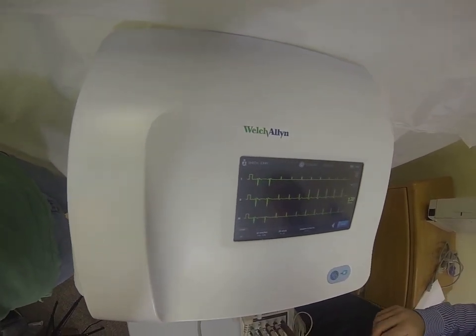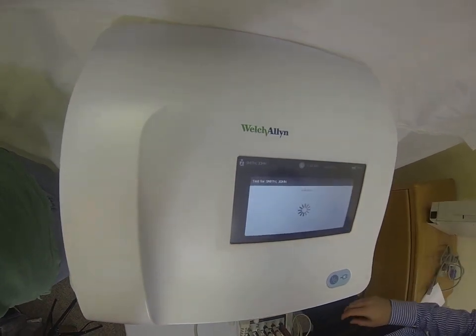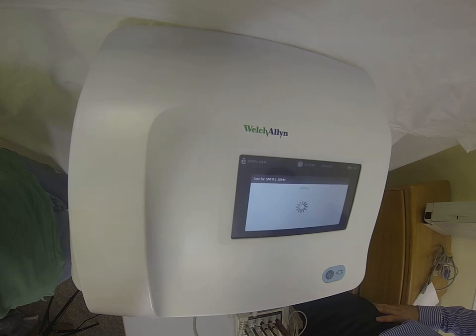Once you're satisfied with your connections, it's just one click of a button — we'll hit print. It's going to capture 10 seconds of real-time data and print out your report.